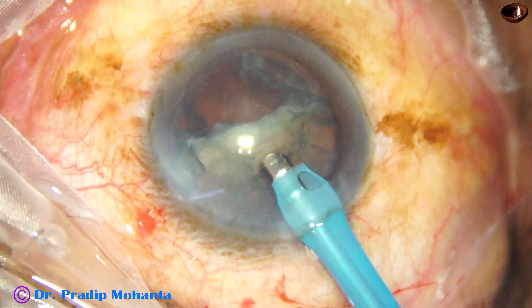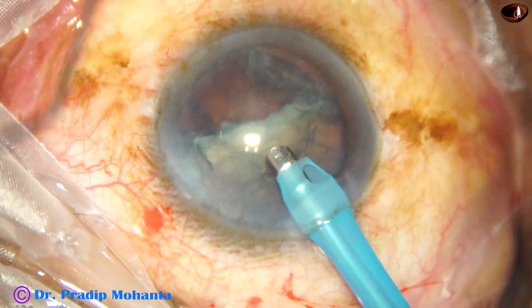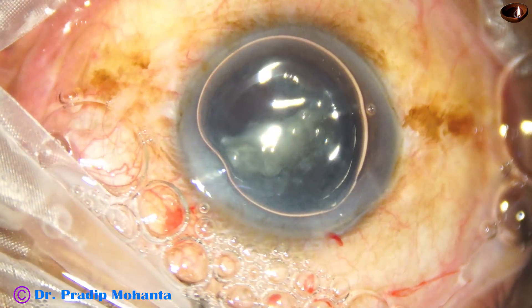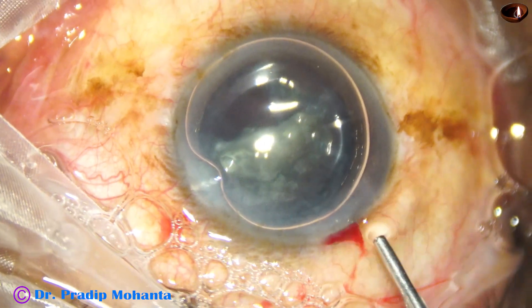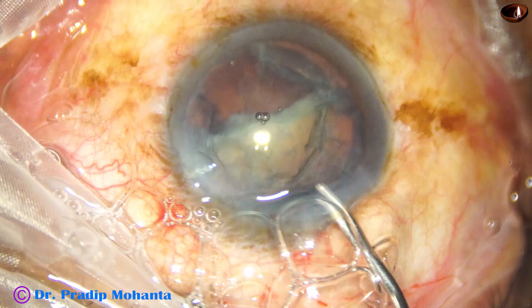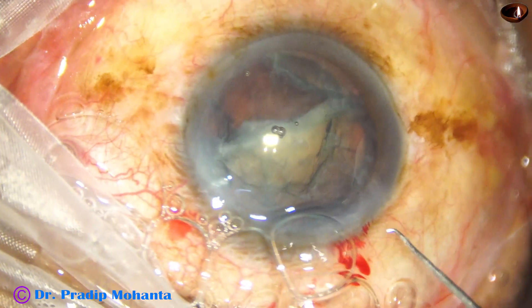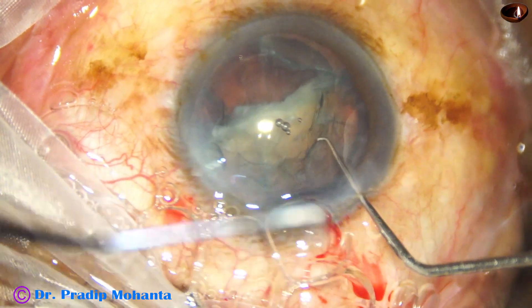Ultrasonic energy used is 65%, flow rate is 45, vacuum is 450 mmHg. Now I come out and for the first time inject air, because air is easy to inject. Then I am going to replace this air with viscoelastic. This technique: ask your assistant to push some air while you hold the syringe, then push the visco through the main port.